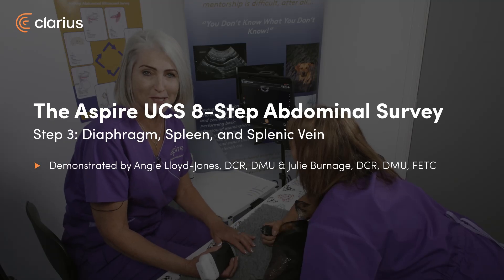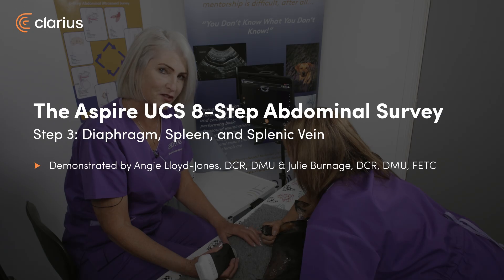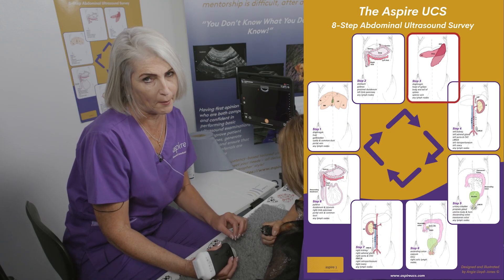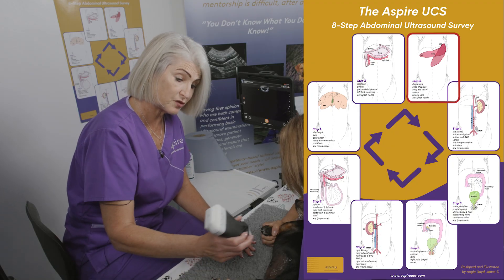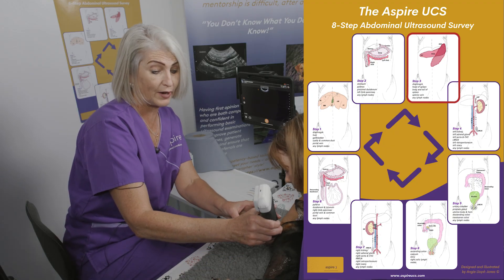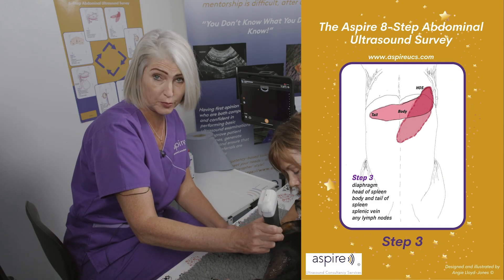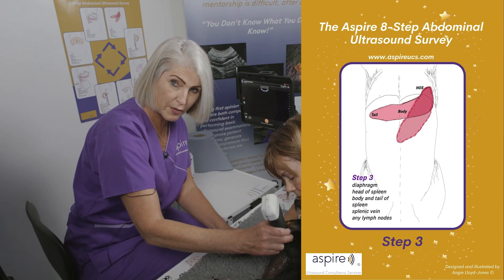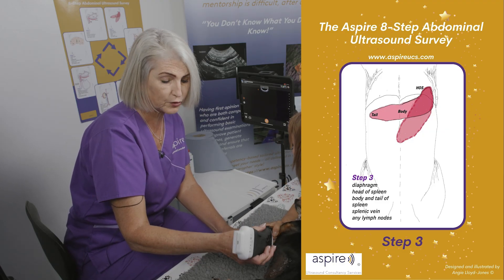Today we're going to go through step three of the Aspire UCS 8-step abdominal survey. Step three is probably one of the easier steps to start mastering if you're new to ultrasound, mainly because most of the structure of the spleen is quite superficial. It's also approached from the left side, the upper surface of the dog, so it's a good one for practicing your motor skills because we tend to use quite large broad strokes for that.